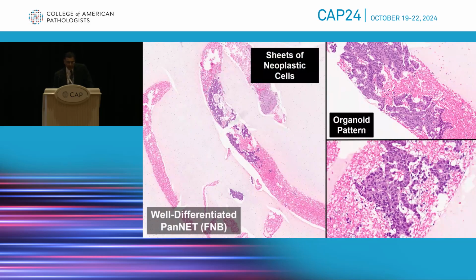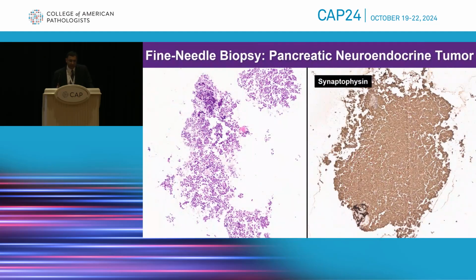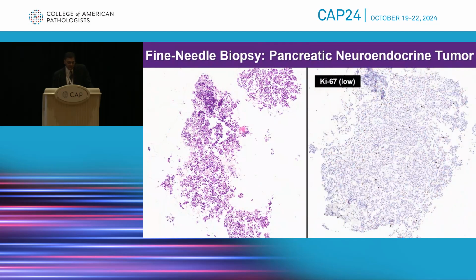In addition to exocrine neoplasms, endocrine neoplasms should always be in your differential, and those include specifically pancreatic neuroendocrine tumors. They often adopt an organoid architecture, with ribbons, trabeculae, and/or nests. Stains are similarly important in establishing the diagnosis. That includes synaptophysin and chromogranin, and INSM1 can certainly be helpful, especially as a nuclear stain. But that's really just half the battle, as you know. When it comes to neuroendocrine tumors of the pancreas, it's all about grading, and that's basically counting Ki-67 and mitotic index in general, and establishing the WHO grade itself. We'll talk a little more about that, but it's actually important for operative planning for a subset of neuroendocrine tumors of the pancreas.